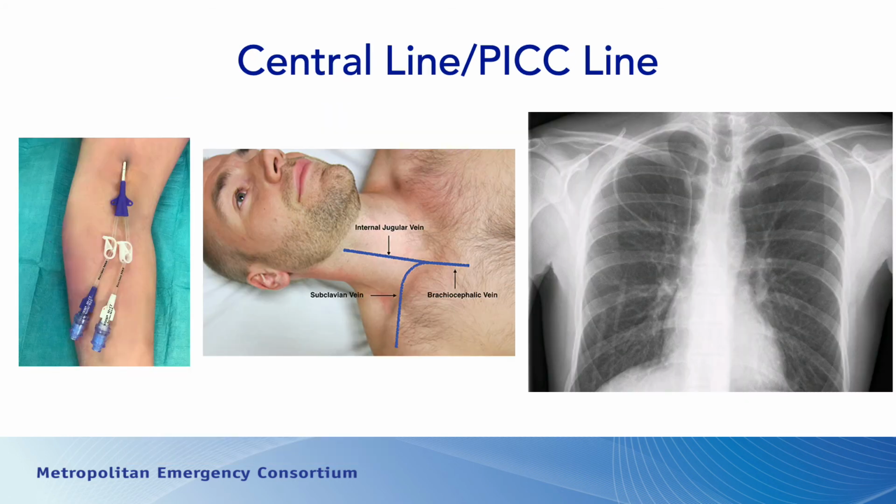Central lines, you'll see those out there. We see more and more PICC lines on patients who are at home. Typically, these patients need them either for hydration, but more commonly because they need 4 to 6 weeks of intravenous antibiotics, and we don't need them to be in the hospital during that period of time. So we have those out there, and they are available for your use.